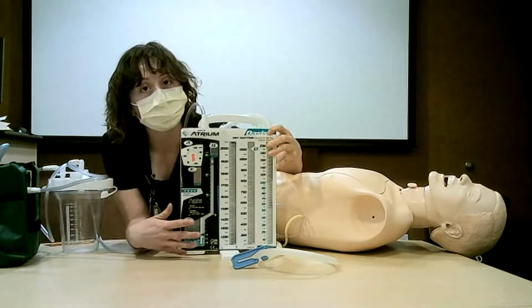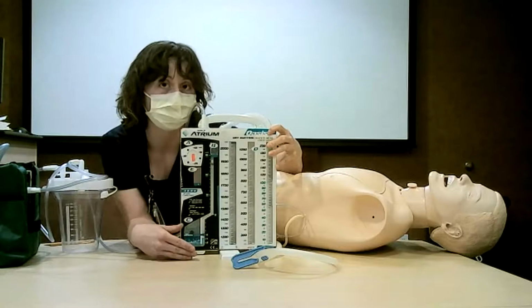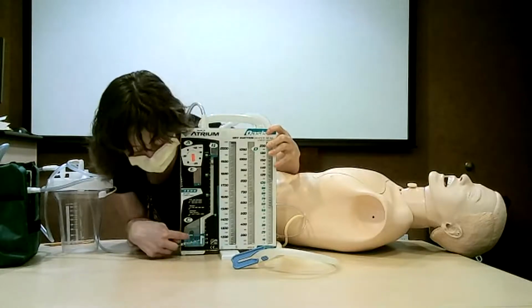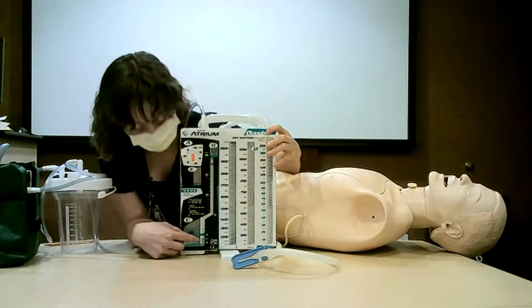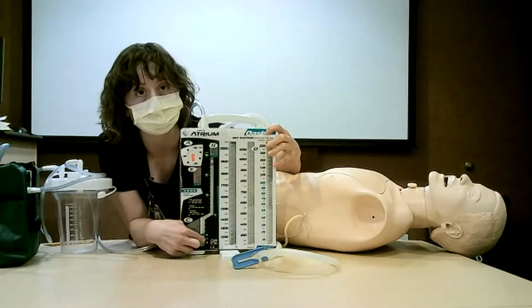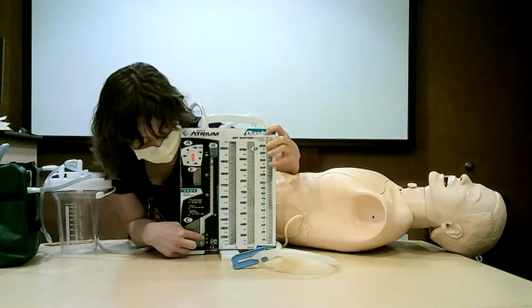Various patients may develop air leaks. If the air leak is new, as in they haven't noted it on the last shift or for the last few days, make sure that you're telling the surgeon, because that is a significant change that they need to be made aware of. Another thing you may note here is if it's tidaling. That will be when this white ball in this column moves up and down based off of the patient's breathing pattern. That's nothing to be alarmed about, but it should be noted in the charting.